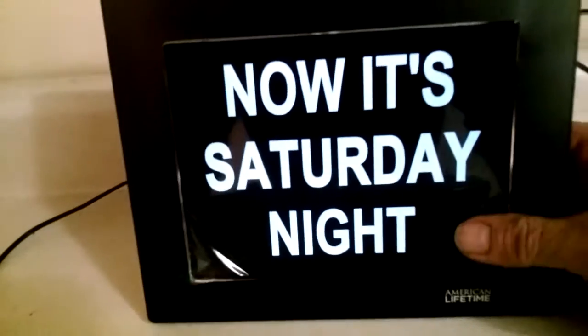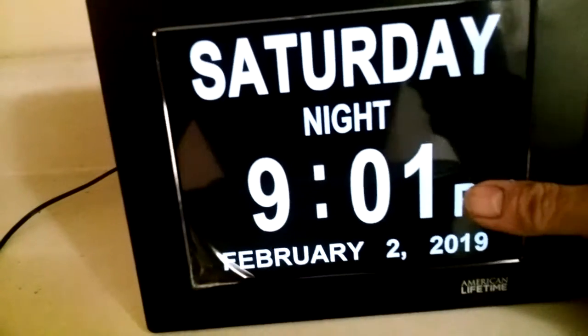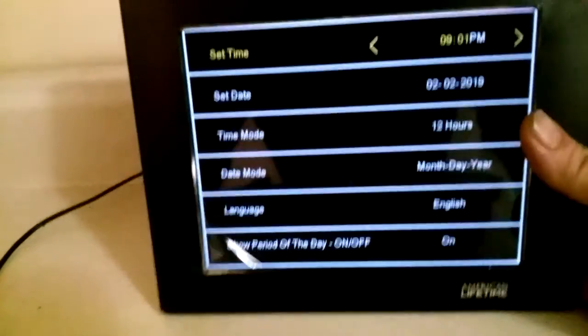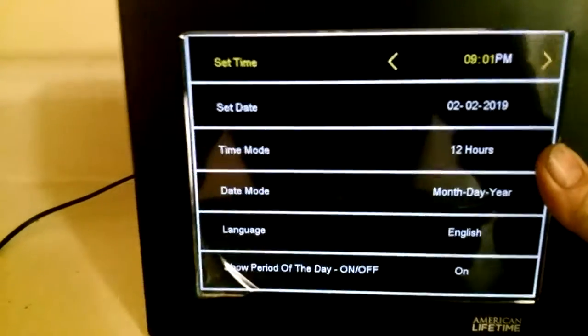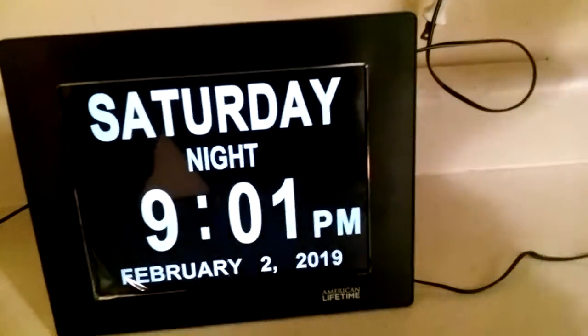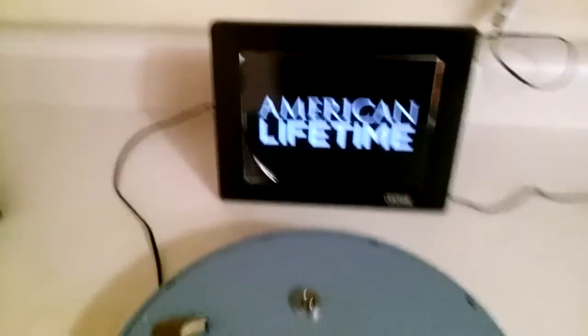There are a couple of little options you can set with a button in the back. The menu is real easy to set - there's the menu where you can change 24-hour format and all that. It keeps the time when the power is out, but you don't plug it in - I'm not sure which port is which - and it doesn't stay on. It's got a little watch battery.